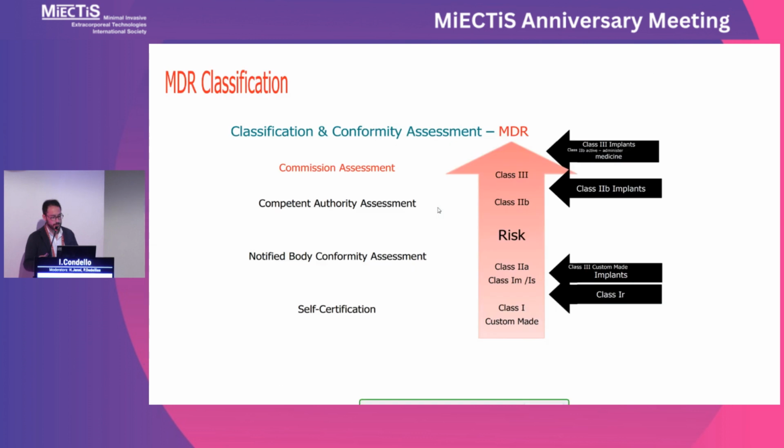And the only problem of this idea is that it is an implantable device and is a class 3 under the MDR, the medical device regulation. Nevertheless, it's really important that today I share our preliminary report with the disposable that we have, all about retrograde cardioplegia, to improve the management of the MiECC procedure.